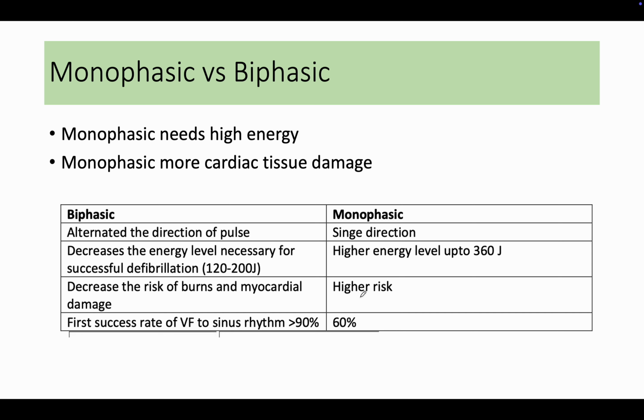There is high risk in the monophasic, and the first-shock success rate of VF to sinus rhythm is more than 90% in the biphasic defibrillator. In the monophasic, it's only 60%. This is a very important topic for our board exam also.